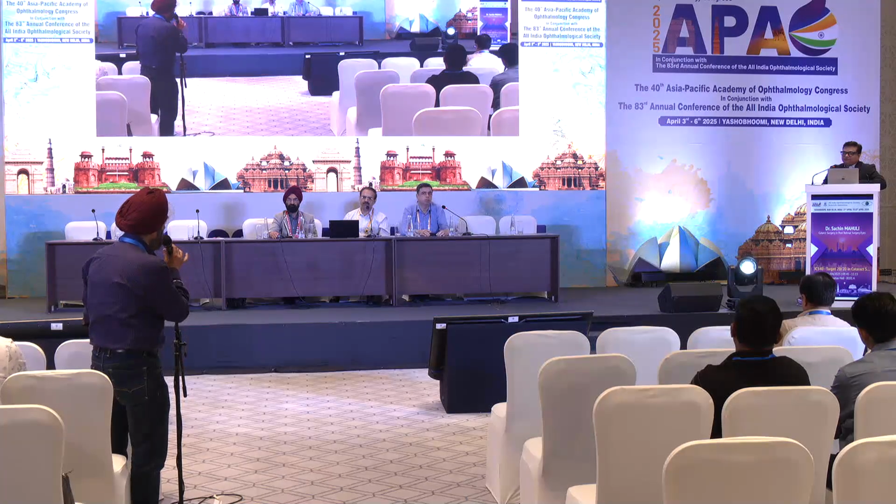You don't use it as a... No, not required. I wanted to add one thing about the IOL. Sir was saying that if you have a huge doubt about the IOL power, you can always tell the patient, I am planning oil removal and cataract removal. The IOL can be put in the next day.